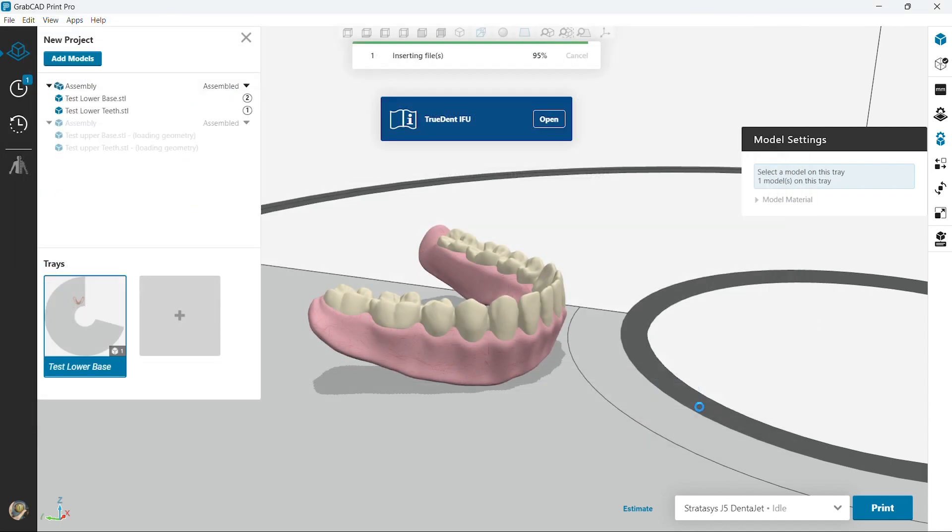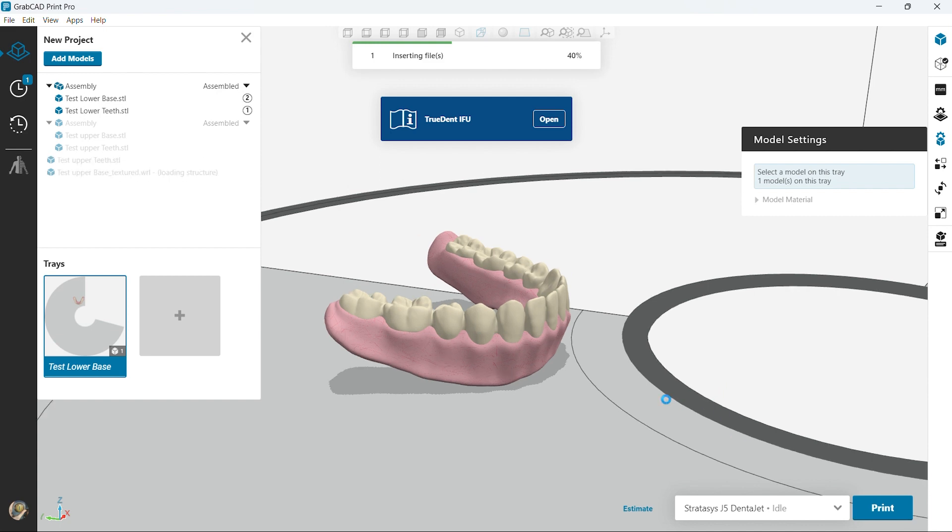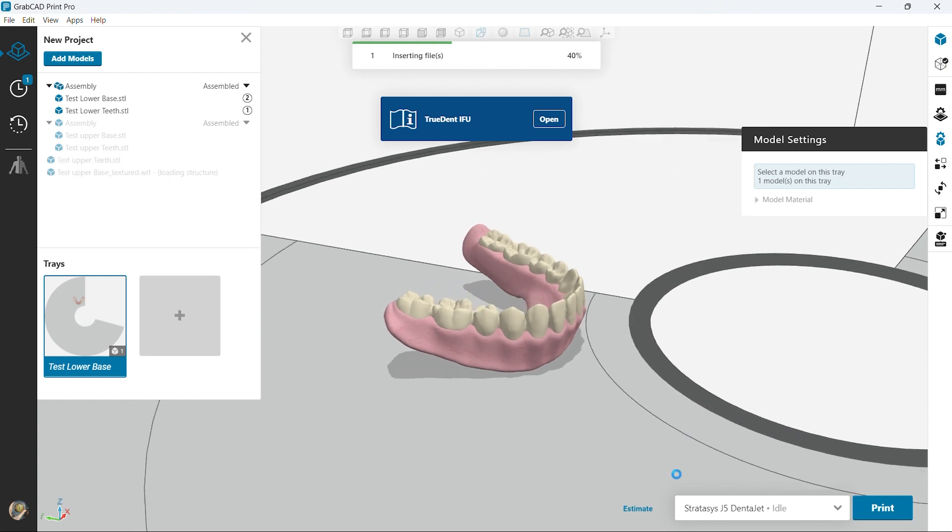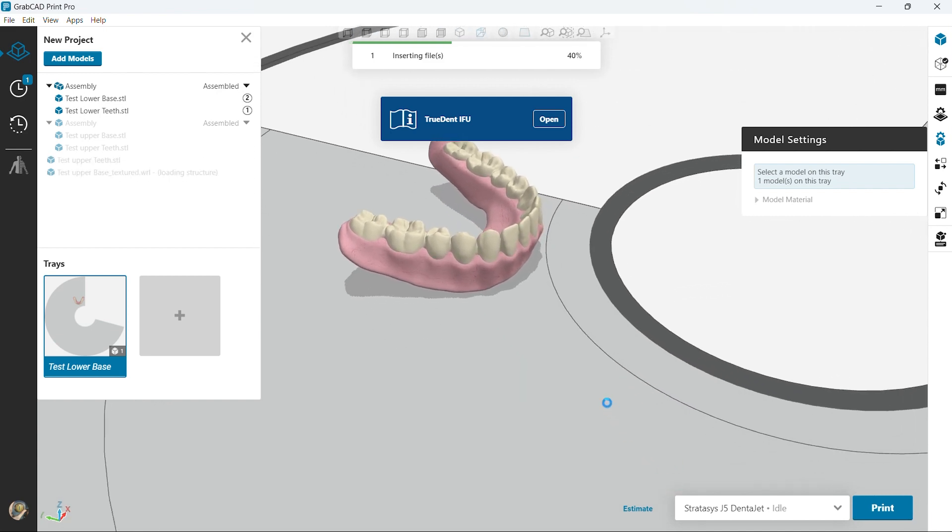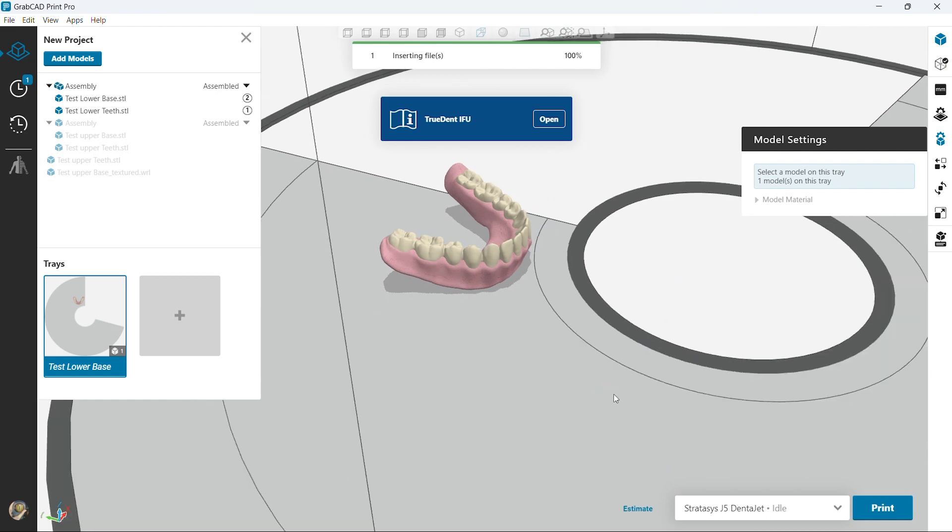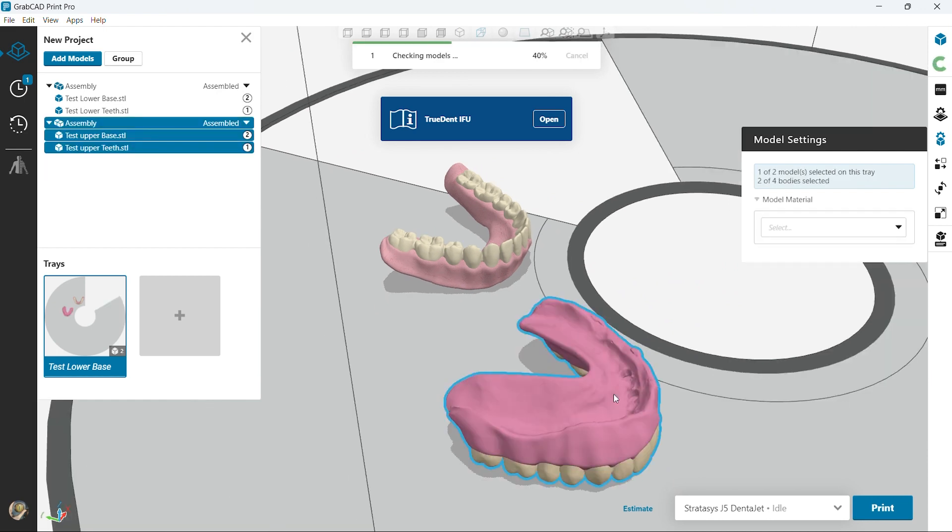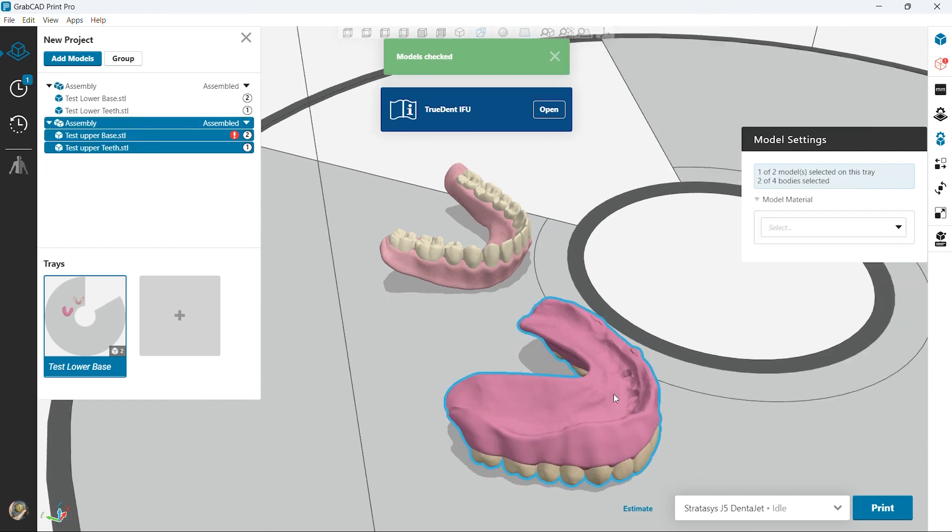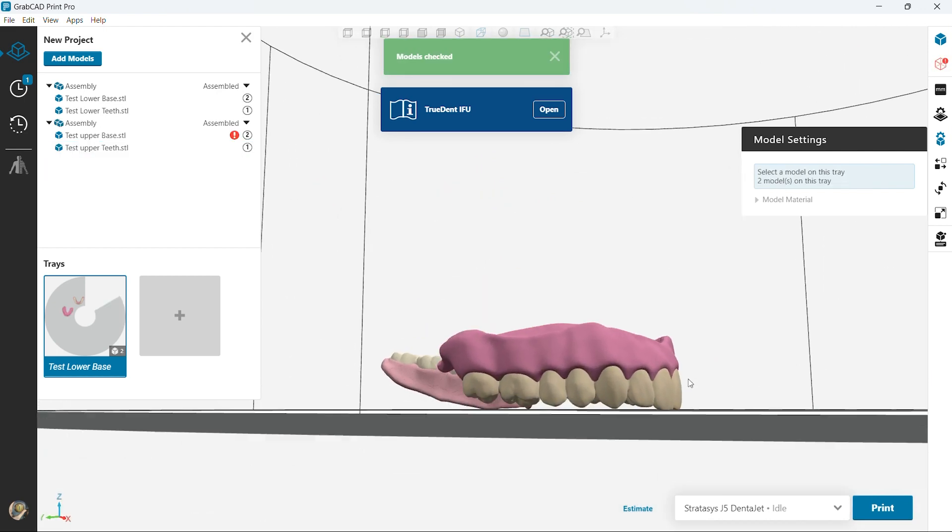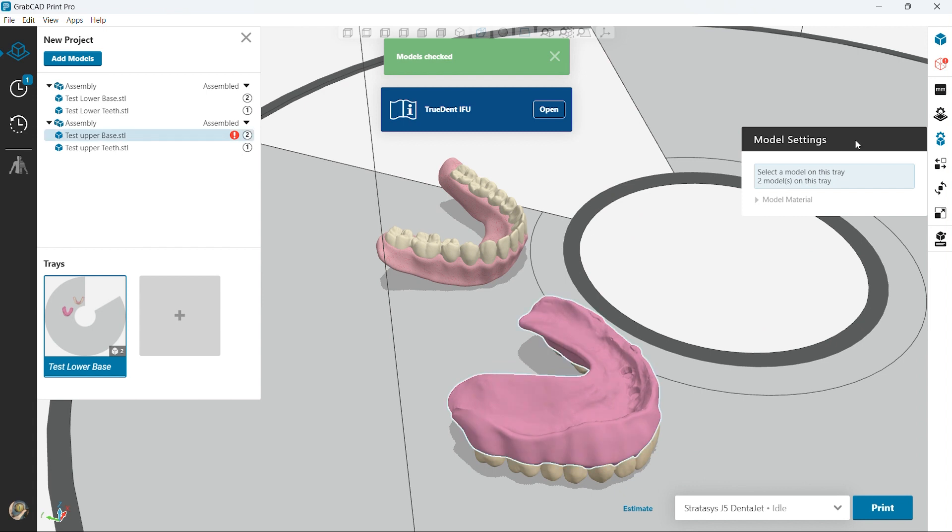So right here I'm gonna go ahead and add in an upper denture as well. On the tray itself you can mix different colors, different shades in one print. I'm gonna go ahead and just play with the orientation here and flip it around so we can see it a little bit better.